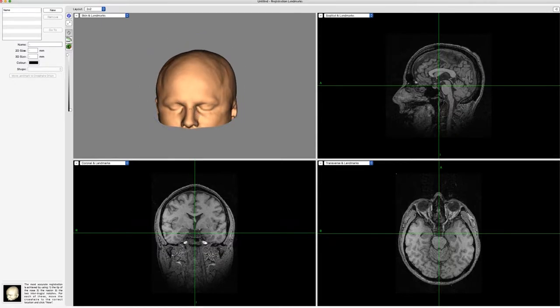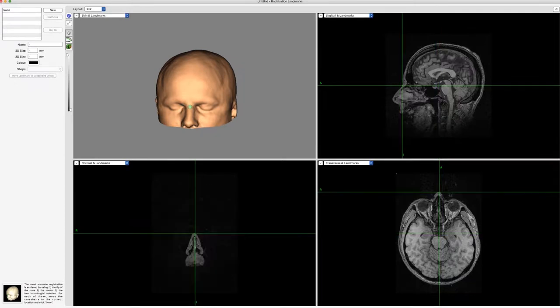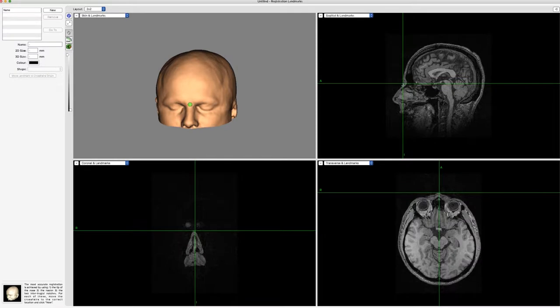So first one there is the nasion. If we click right there on the bridge of the nose, you can see here on this one, we want to bring that up slightly because in this patient, it's not quite in the right place. So if we bring that up there and we set that first landmark, go to new, landmark one, call it the nasion. So we set that. Okay, so when you get that little red box, that means that landmark has been set.